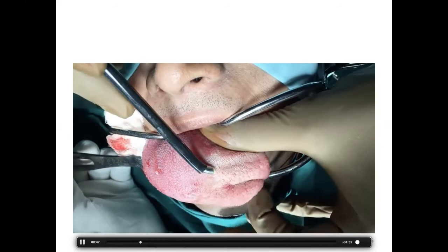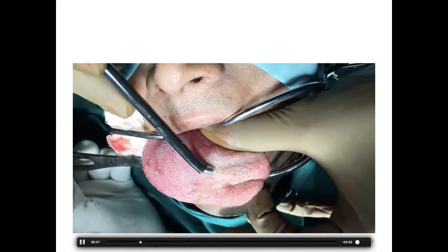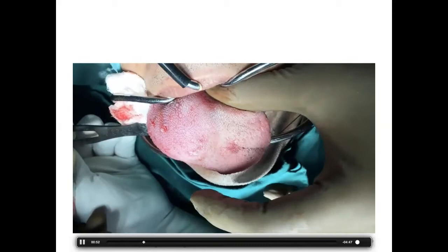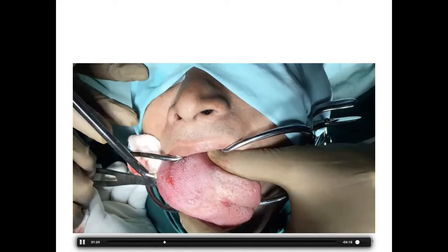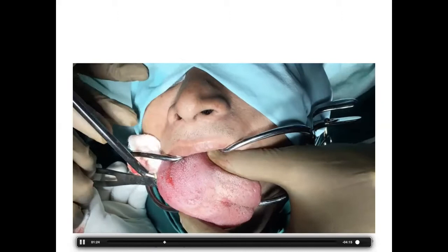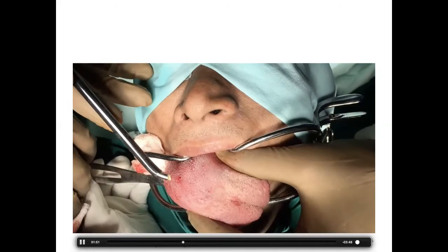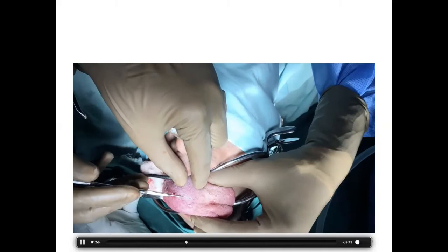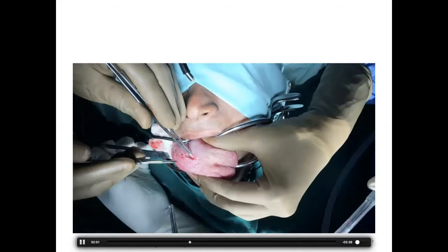Using a Jennings mouth gag, we pulled the tongue outside with a stitch and used the coblator to make a midline incision. Then, to avoid transmitting electrical energy near vessels or nerves, we switched to a cold knife and elevated in layers.